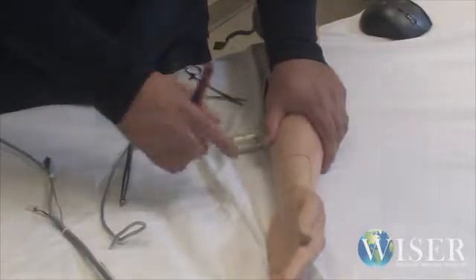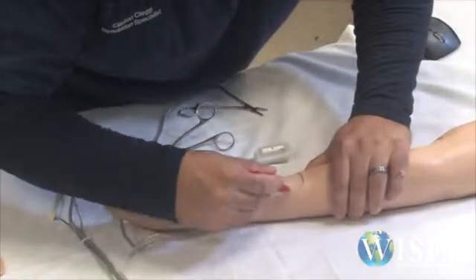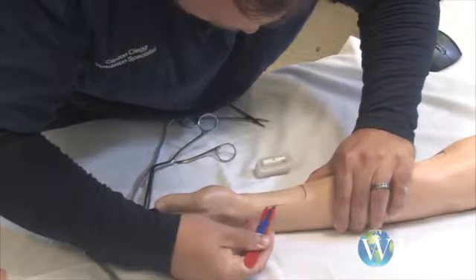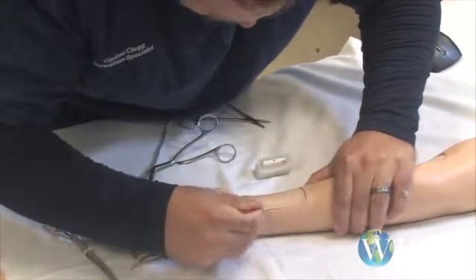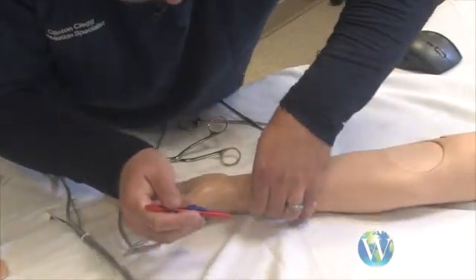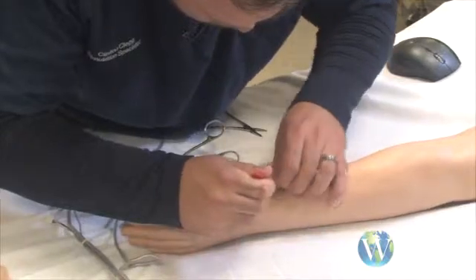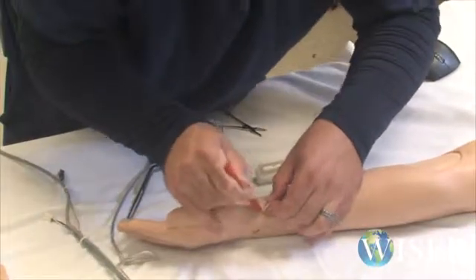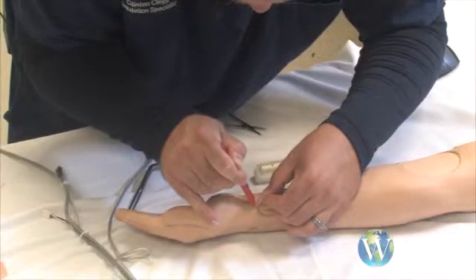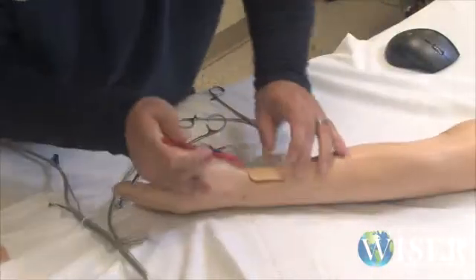So what you really want to do is be very careful and get past the glue, go right along the crease, and get up under. Use your fingernail a little bit and make sure that you're not destroying the skin flap, because you'll want to reuse that later. So you get under with the razor, and once you get it going, it kind of comes right up. But again, be very careful and make sure you're not tearing the skin flaps, because we will reuse these when we're done. So we got one side.